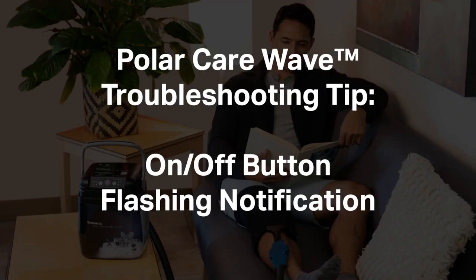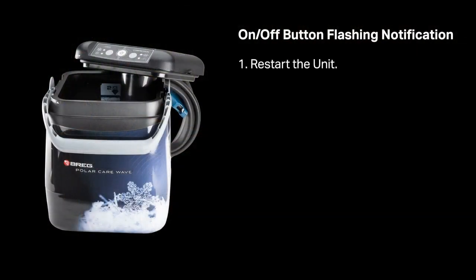Wave Troubleshooting Tips: the on-off button is flashing a notification. Restart the unit.